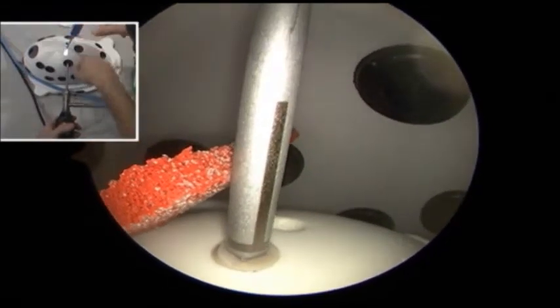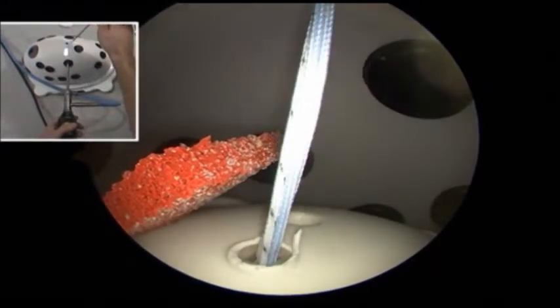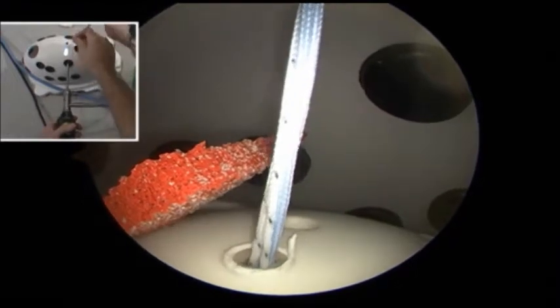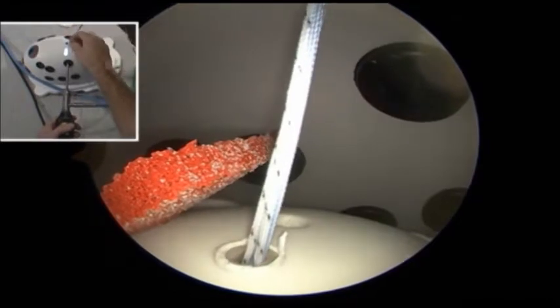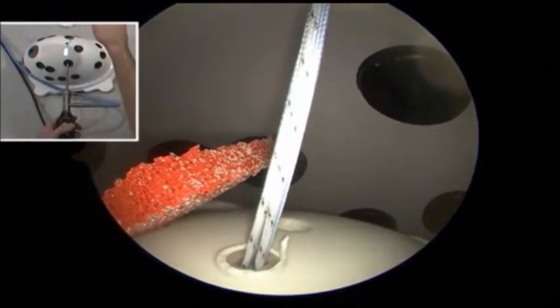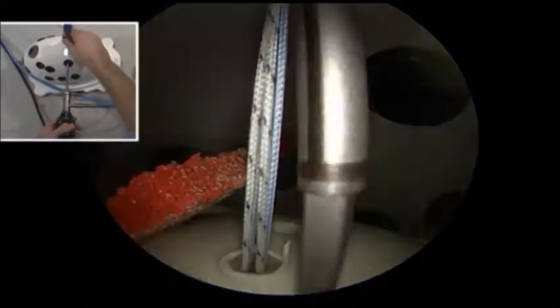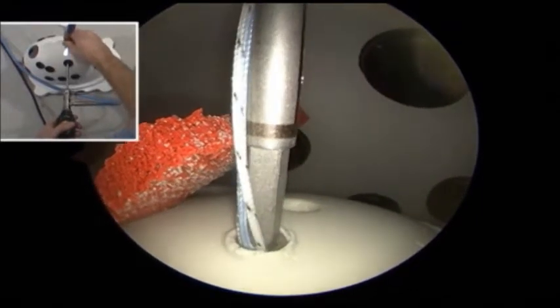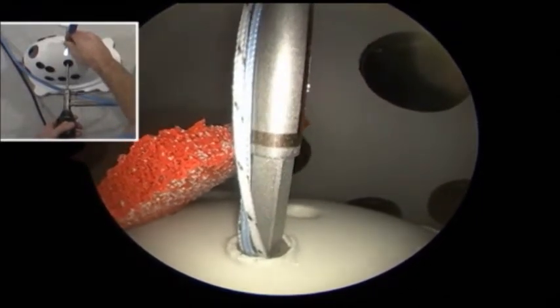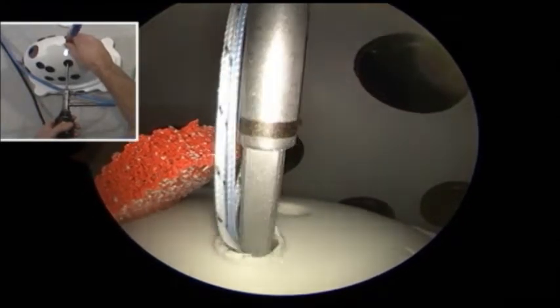If you were to do that by taking it all the way off at this point, we would not be able to then reload the sutures onto the insertion handle. If you try to go down here without the sutures in the insertion handle, you can't get in this little square to twist this down any further. So if you've left this proud, you've really made some significant work for yourself if you want to try to rescue that.